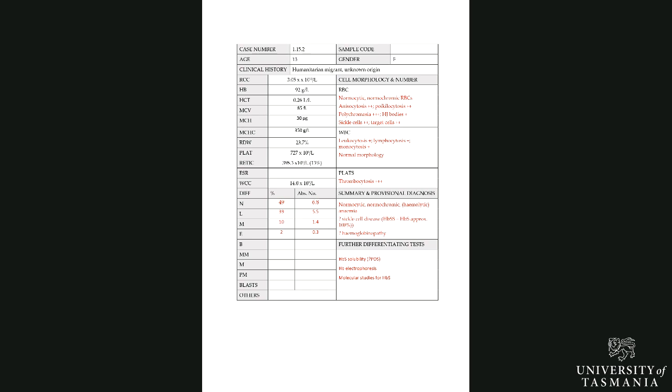So when you see a normocytic blood picture with a lot of anisocytosis and an increased retic count, that should suggest to you that we've got some sort of a hemolytic condition going on here, because that RDW is showing us probably that we could have spherocytes there, we could have a lot of polychromasia there. And the reticulocyte count is certainly pointing to some sort of a hemolytic situation.